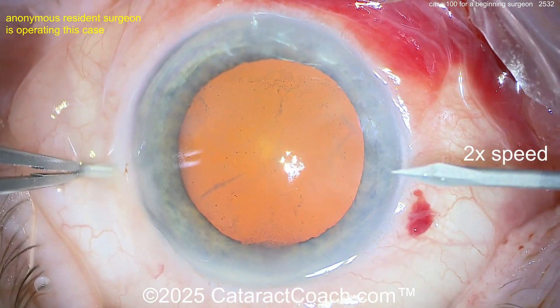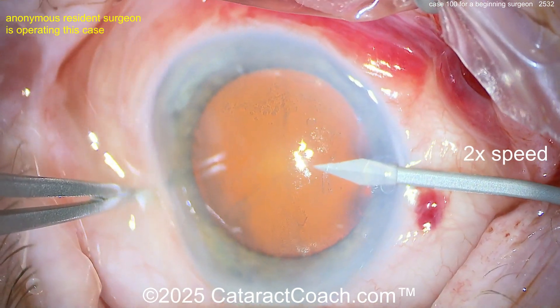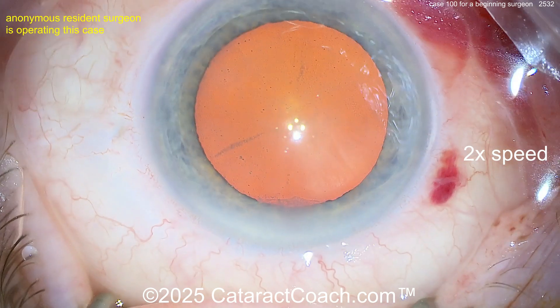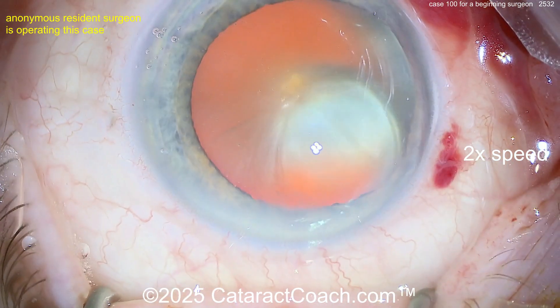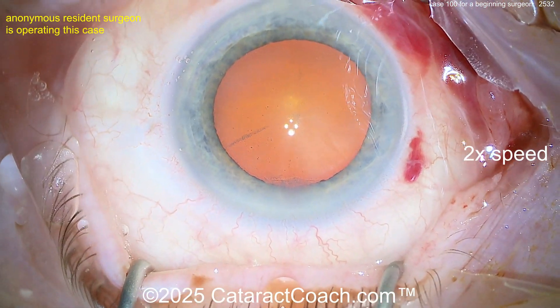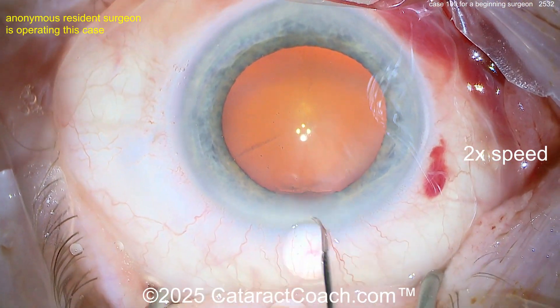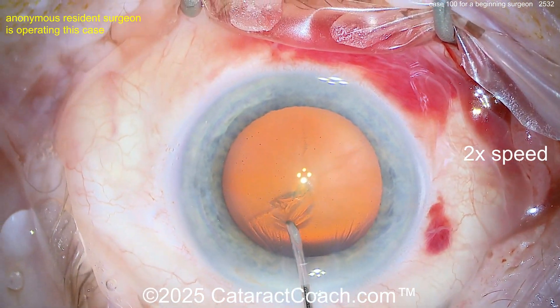Holding on to the eye here, maybe fixating the eye — another paracentesis. We're probably going to do some bimanual. But when you poke and grab the conjunctiva like that, look what you get — subconjunctival hemorrhage. If I'm going to have cataract surgery on my eyes, don't keep grabbing my conjunctiva and causing subconjunctival hemorrhages. Be more elegant than that. And look at the main incision — the roof is not matching the floor, and you started too much in the clear cornea.